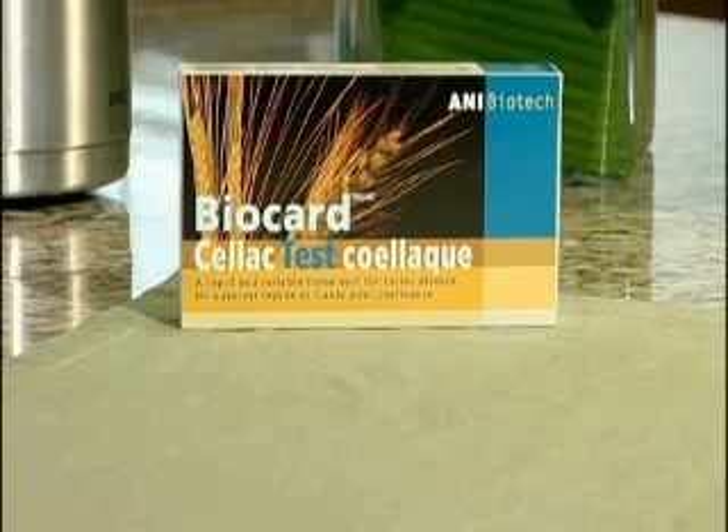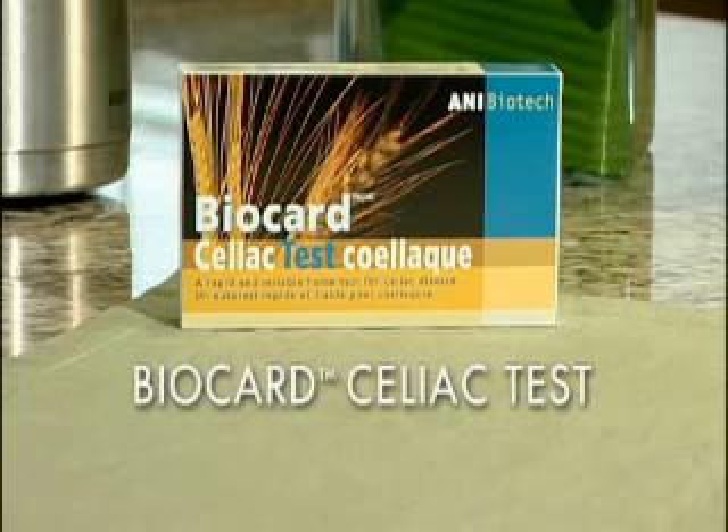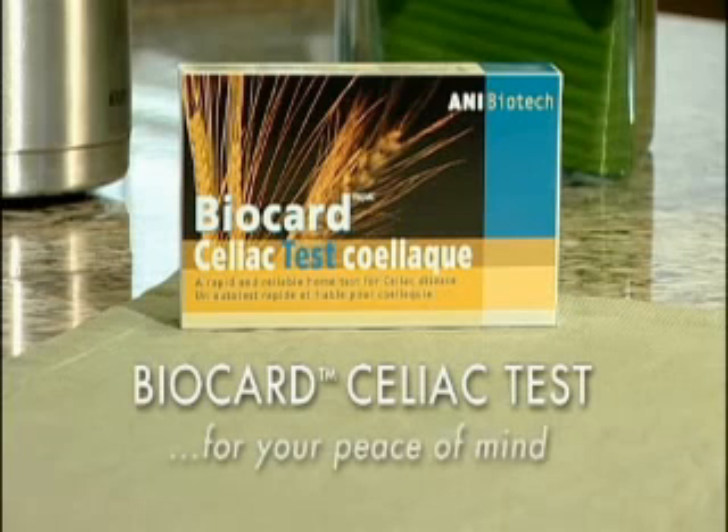Whether your result is positive or negative, the BioCard Celiac Test is the first step in knowing if your symptoms may be caused by gluten intolerance. Now, both you and your family have taken the first step towards personal peace of mind.